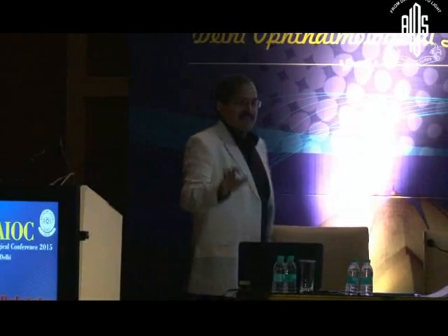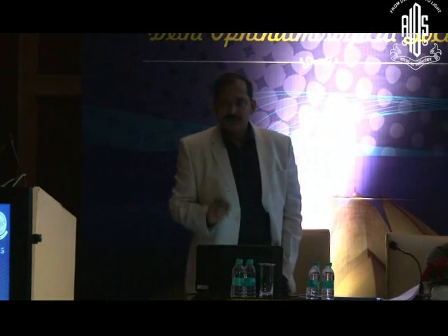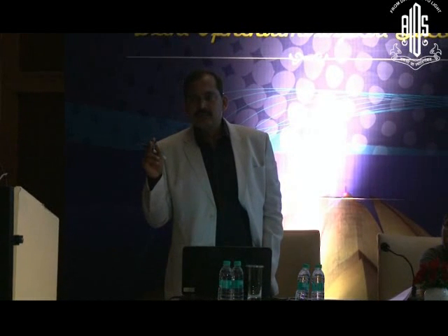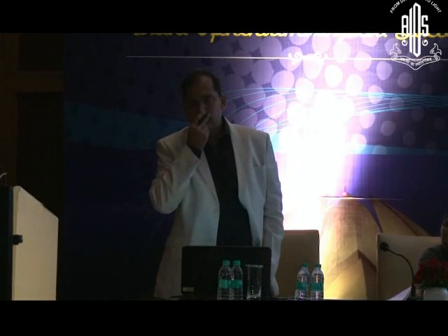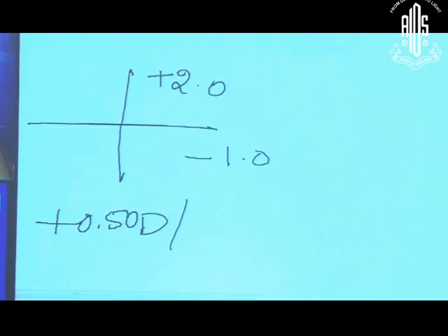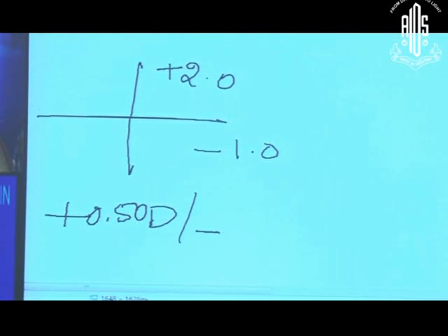Okay, I'll make it simple. This is a dry refraction. What is dry refraction? No cycloplegia. This is at 2/3 meter. Now quickly, 3 seconds. Plus 0.5. Then what? Minus 3. Minus 3 at?